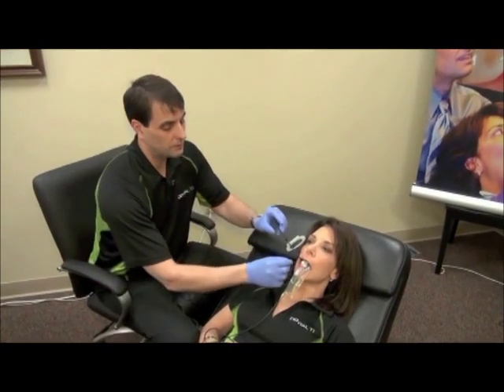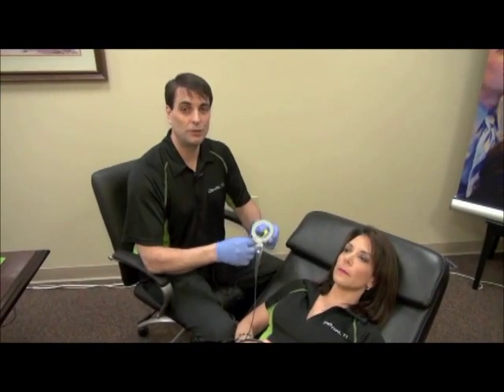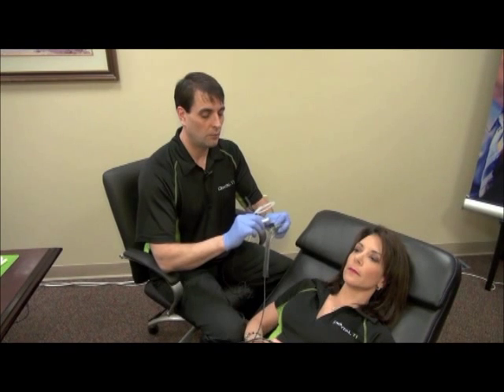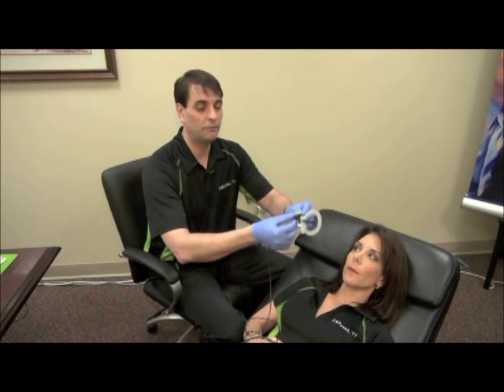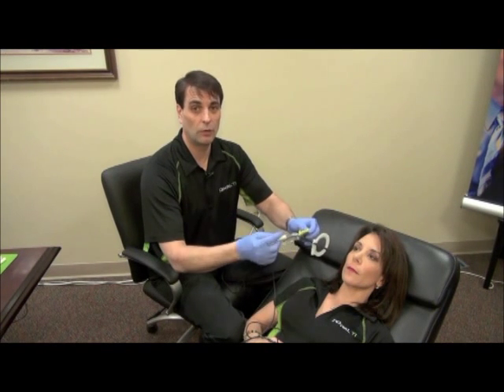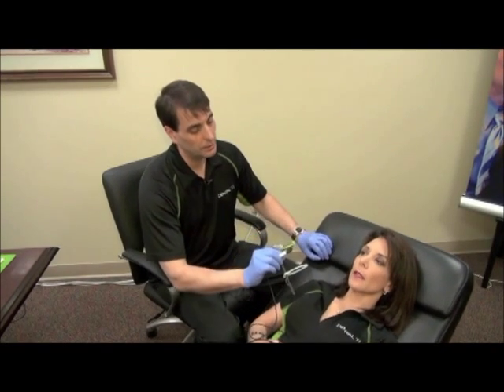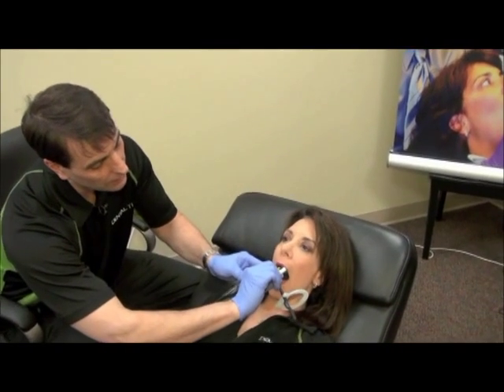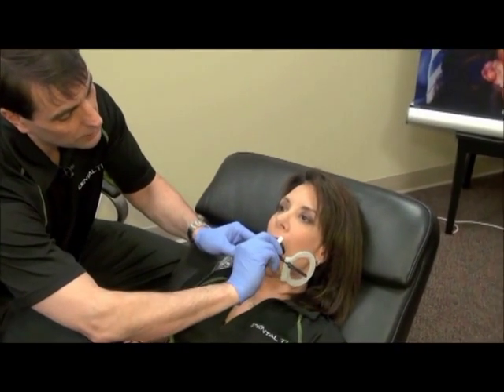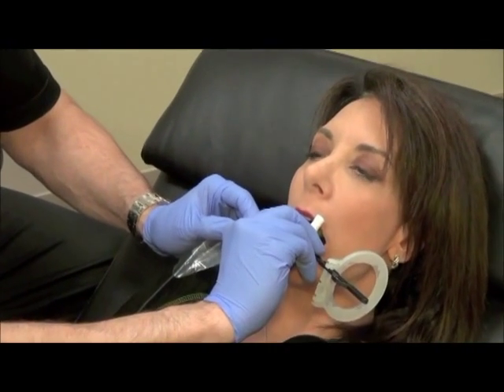That's the upper posterior PA. The lower posterior PA is used with the same holder. When it's configured for an upper right posterior PA, it can simply be flipped over for the lower left posterior PA area. When you're taking this x-ray, the key is pushing the tongue aside and again getting into the middle of the patient's mouth, pushing down on the mandibular surface.